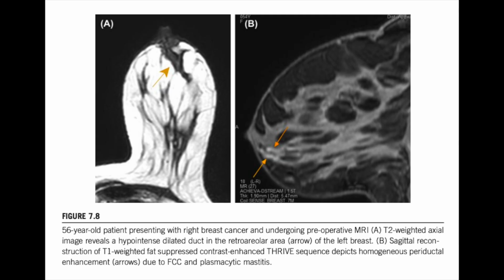Okay. But if that same fibroadenoma has really dense stroma or a lot of epithelial hyperplasia, it becomes very cellular. So it looks crowded. It looks crowded, it restricts water, and its ADC value can actually drop below that benign threshold. So even though it's benign, its makeup makes it look suspiciously cellular on DWI. Yeah. And that can push you back towards the biopsy you were trying so hard to avoid. We've now officially entered the territory of the mimics, the lesions that just refuse to play by the rules.